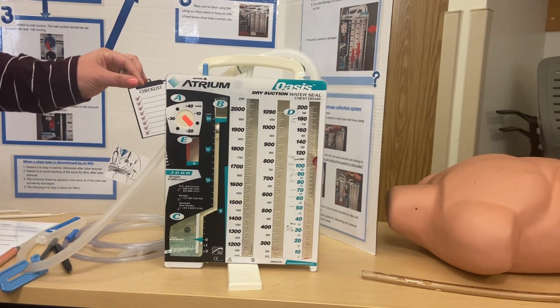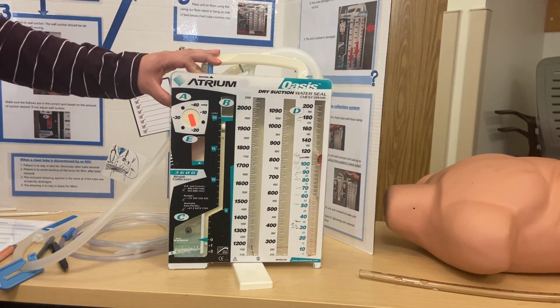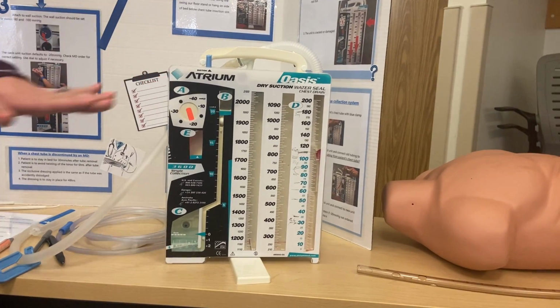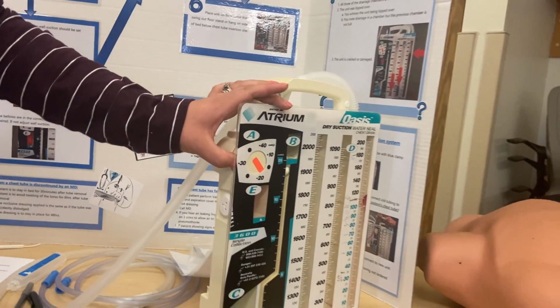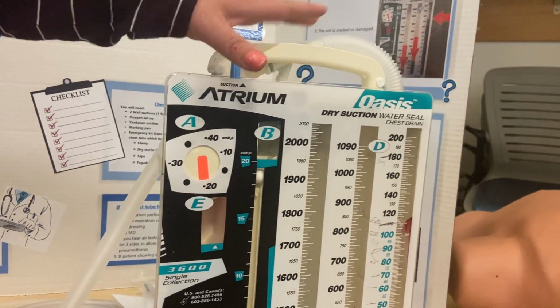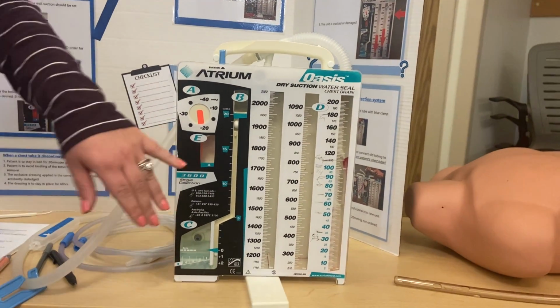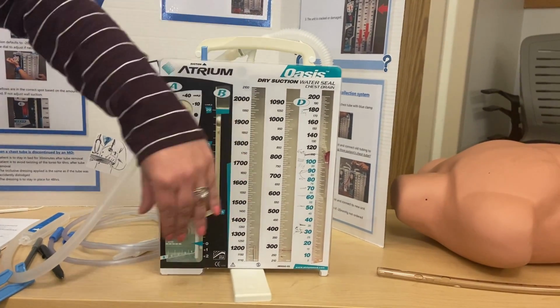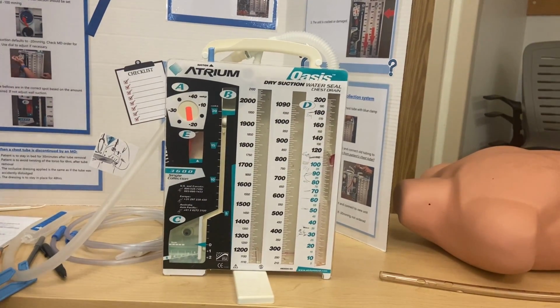When you open this chest tube system, it is going to default on the suction area to -20. So you can leave it there unless the order says otherwise. If the order says put it to a different number, you can take this little rotary dial. This is a dry suction, which means we just control the suction through a little rotary dial on the side here. They do have wet suction systems still, but most places don't use them anymore. That would just mean that the suction was controlled by a column of water, but we don't do that anymore here. So we use the dry suction. So that's the difference between dry and wet suction.